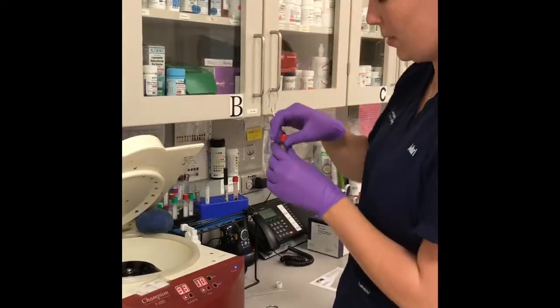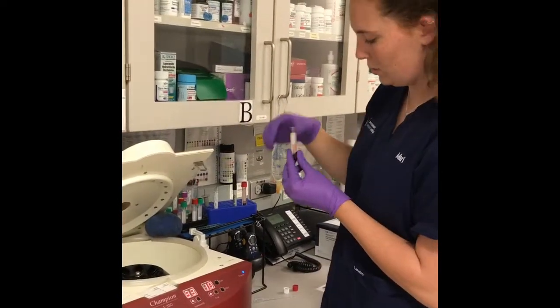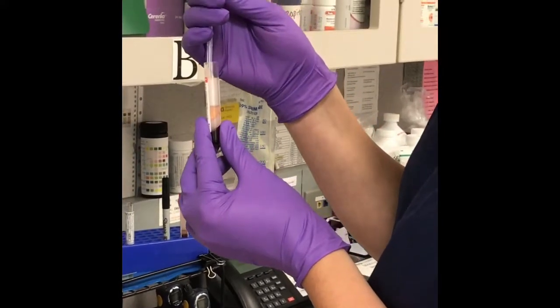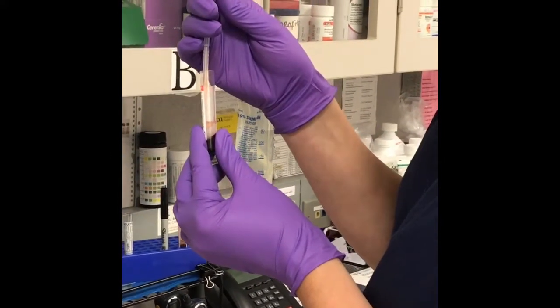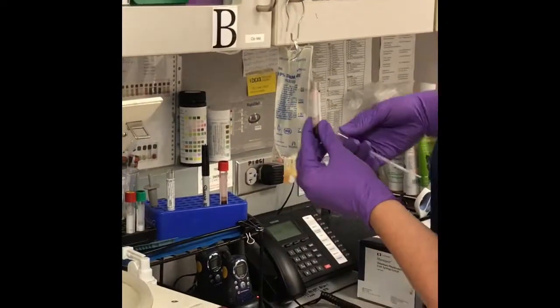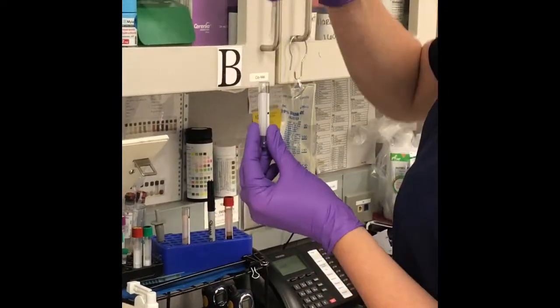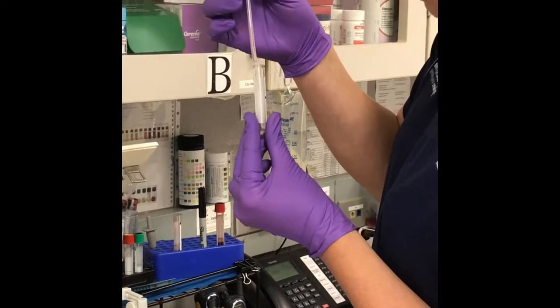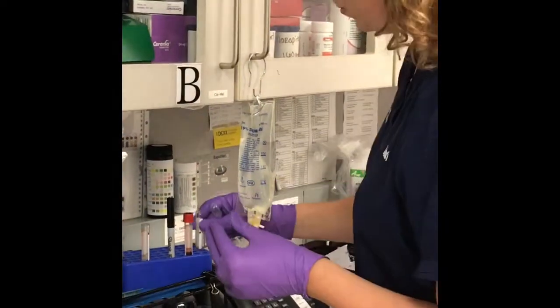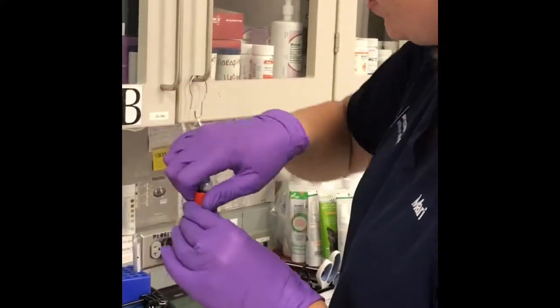I'm going to do our serum separator first. I'm going to use my disposable pipette and squeeze, dip in, and harvest the serum. I'm going to place that in my no additive tube. Go ahead and do the same with our clot activator tube.